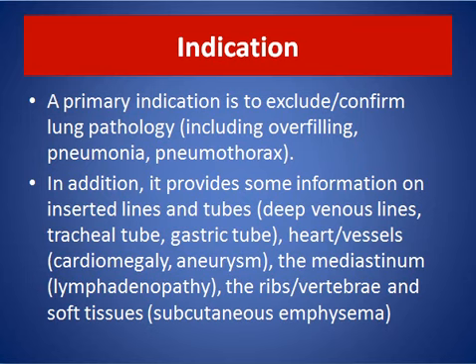In addition, it provides information on inserted lines and tubes like deep venous lines, tracheal tube, gastric tube, heart and vessels, cardiomegaly, aneurysm, mediastinal lymphadenopathy, ribs, and soft tissue like subcutaneous emphysema. And also it is routinely used as a medical checkup and screening in the old age group for lung cancer or metastasis.